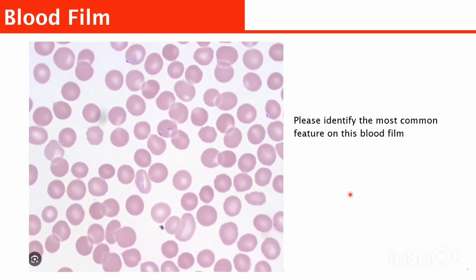Macrocyte means that the sizes of some of the red blood cells appear big, okay? However, if you really want to put it together, we can see that we are seeing anisocytosis. So under the red blood cells, we've seen malaria parasite is present. Under the red blood cell, we can see that we have some anisocytosis. Does that make sense? Okay.